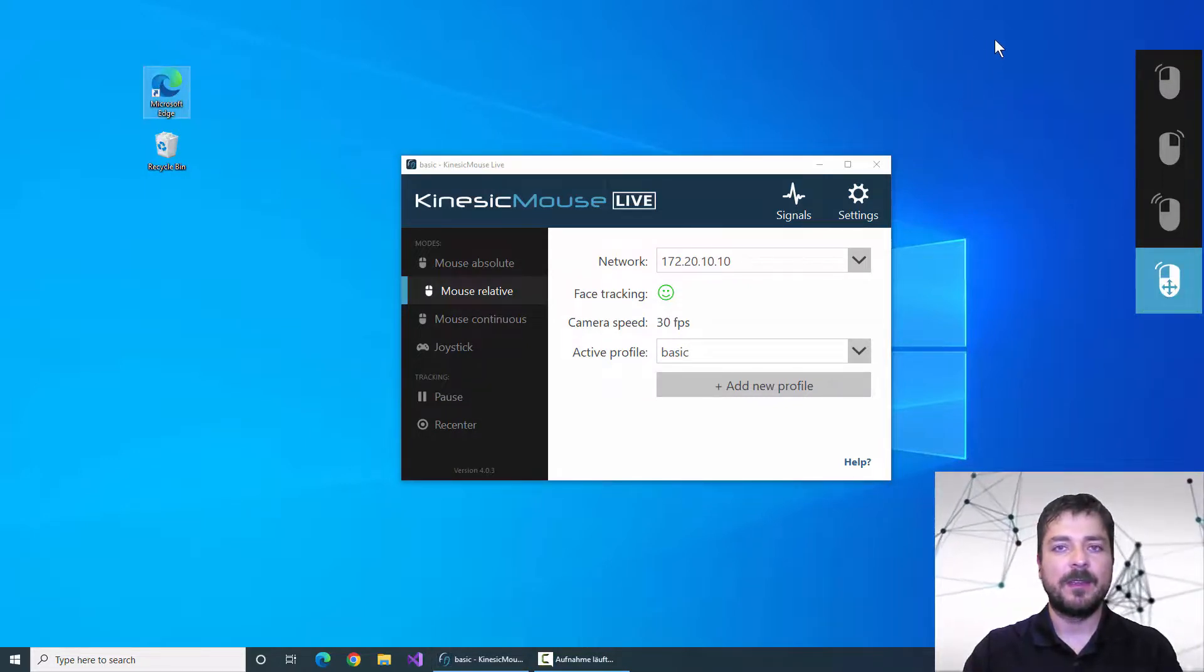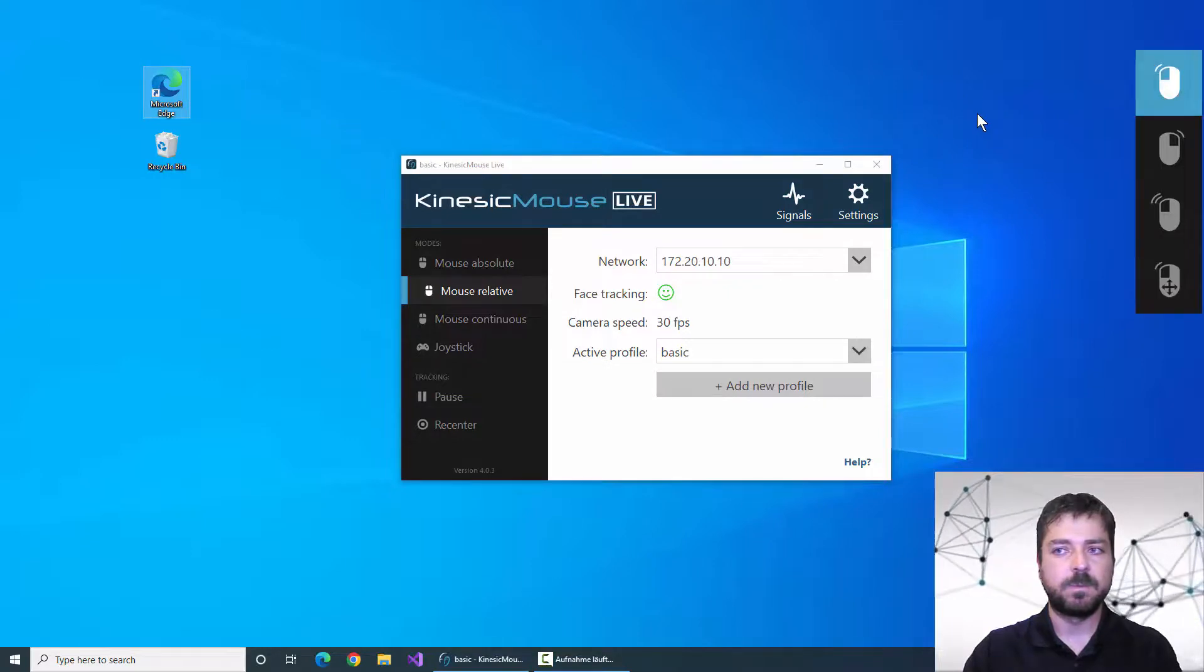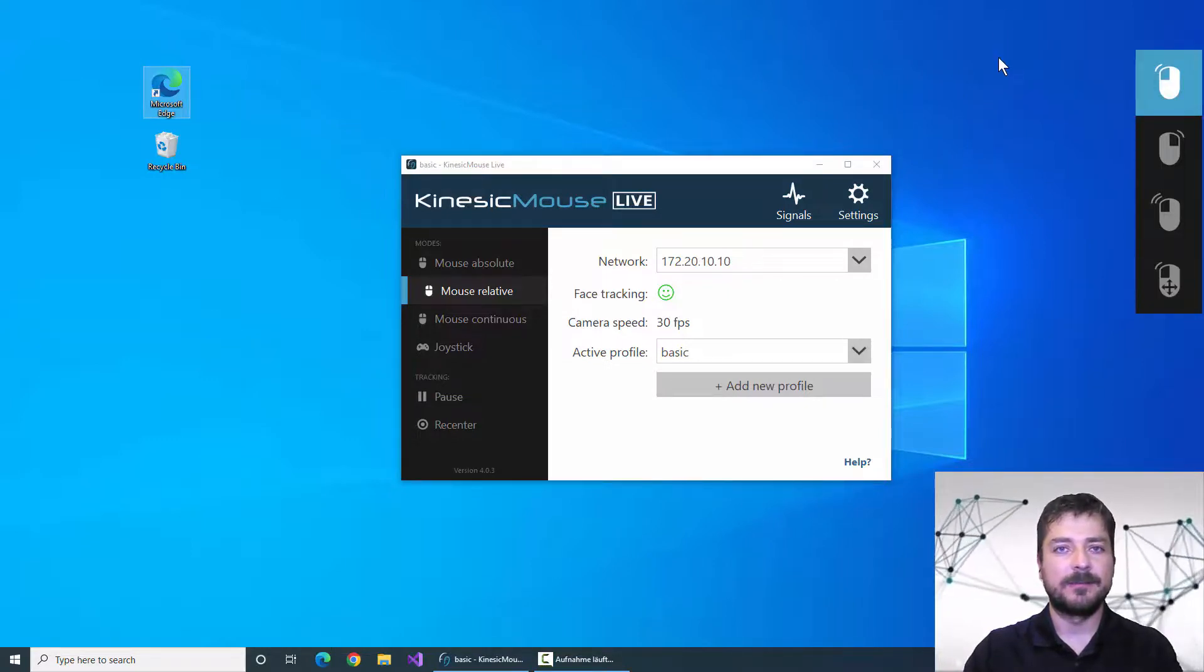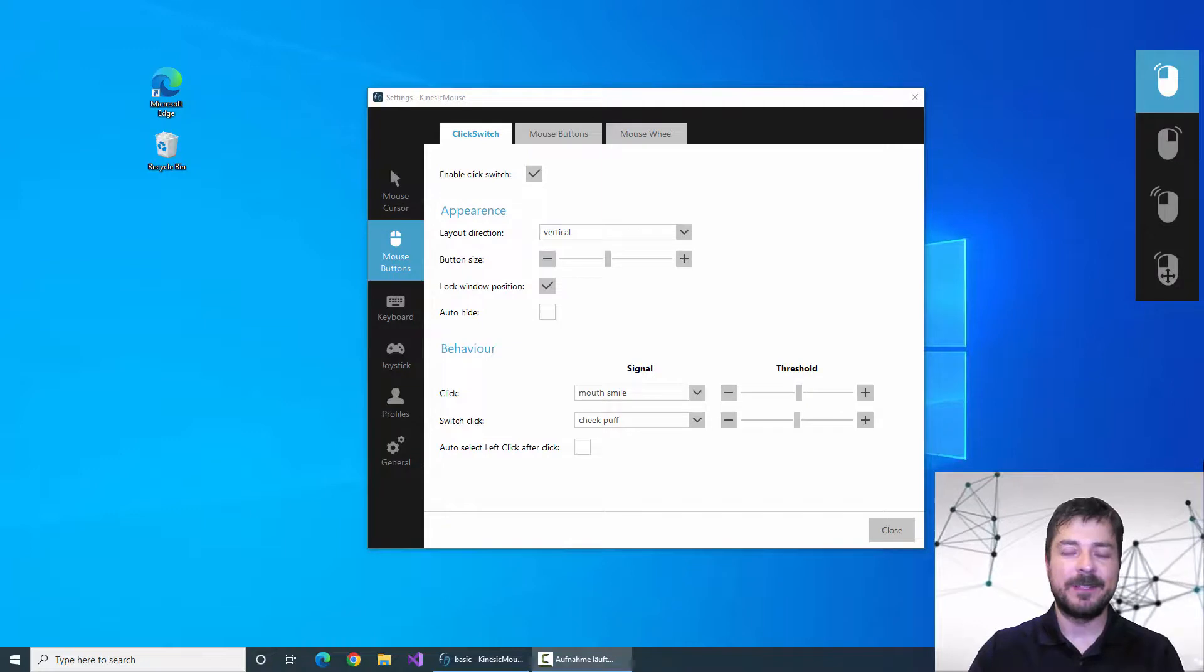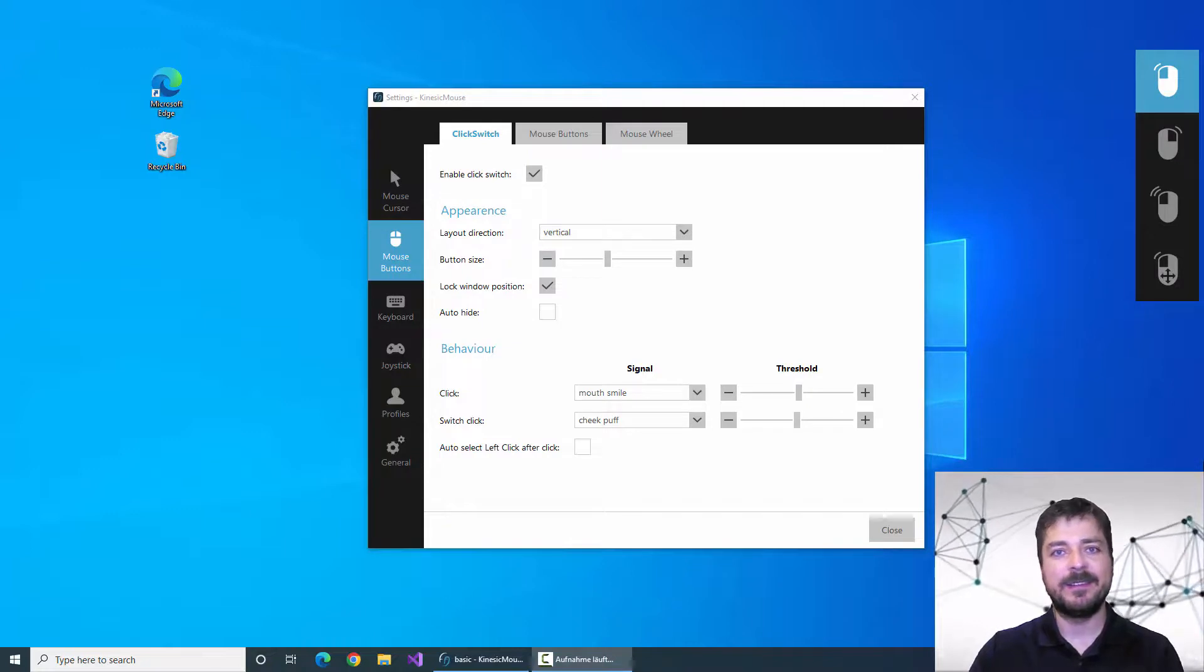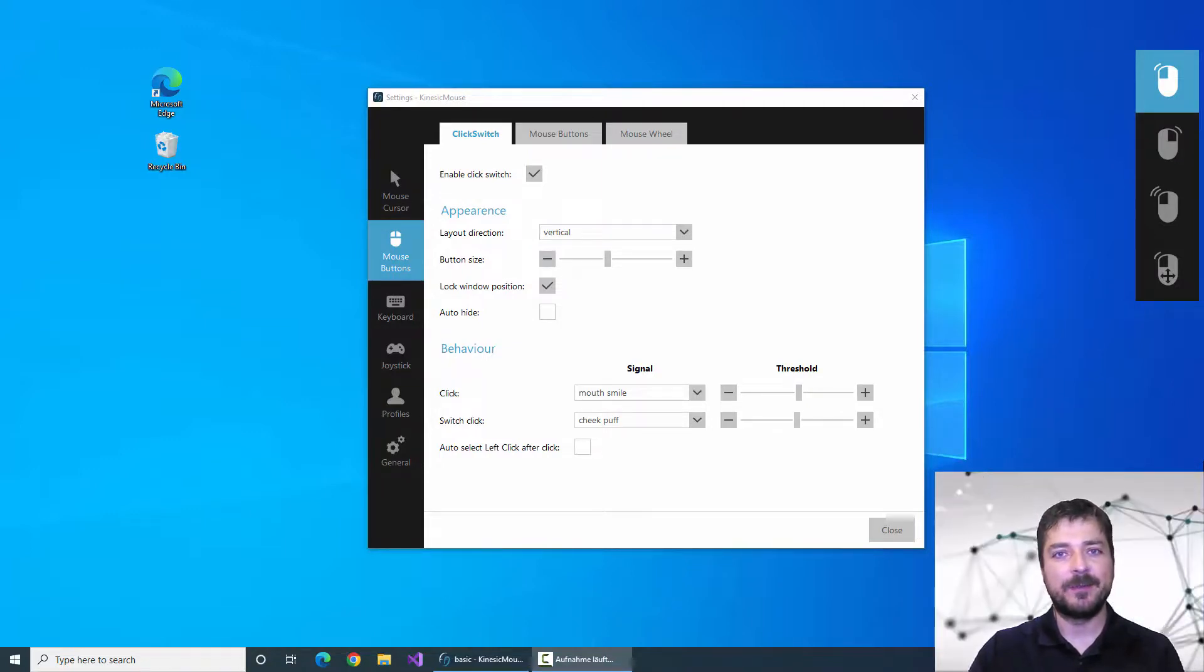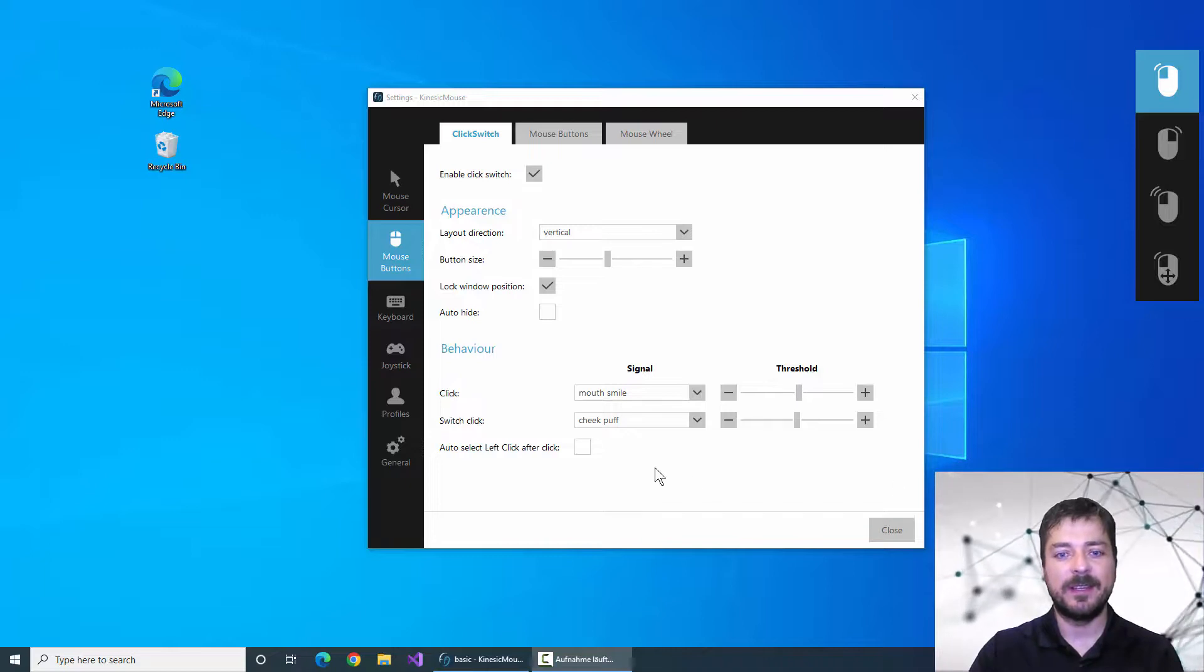I can now puff my cheeks again to select the left click. If I want the left click to be selected automatically after performing another click type I can do so by selecting this option down here.